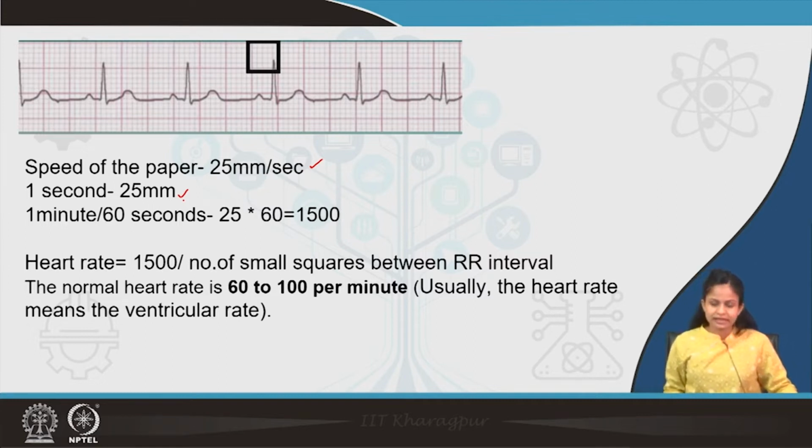So in 1 minute, that is 60 seconds, it will cover 25 into 60, 1500 millimeters or 1500 small boxes.